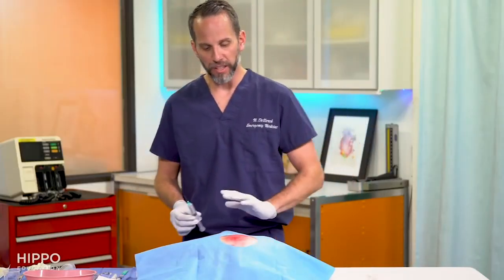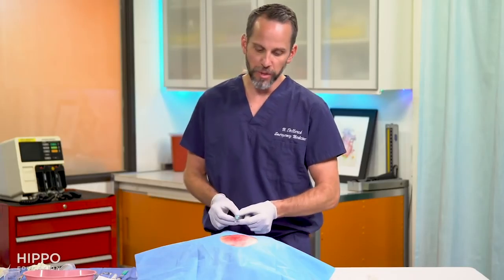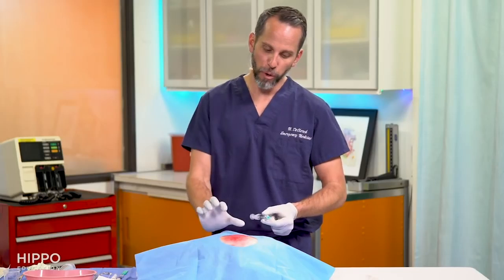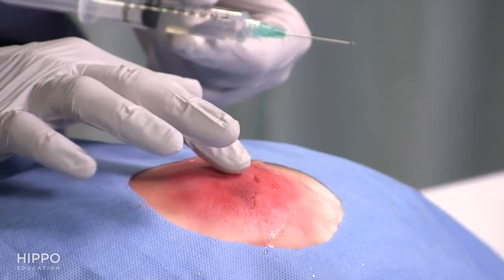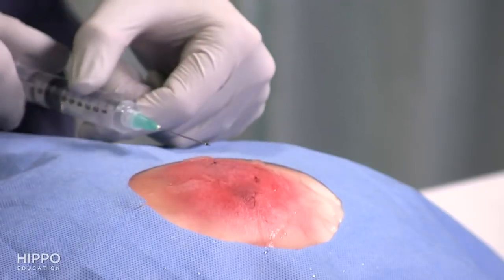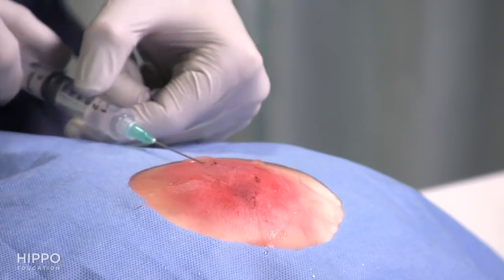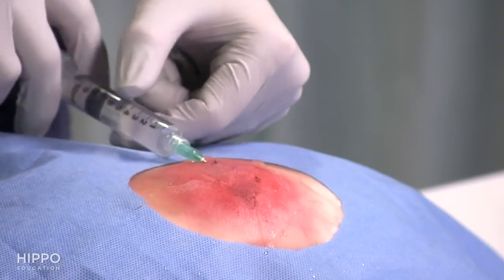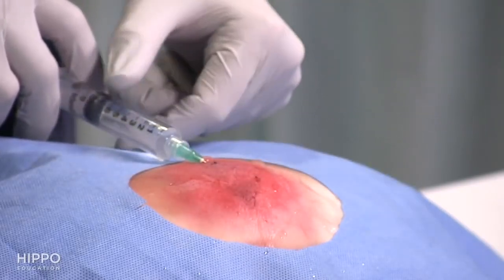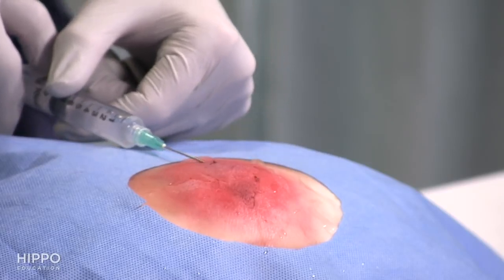After going completely around back to the starting point, the last part is infiltrating the dome of the abscess — you'll be making your incision at the point of most fluctuance. I like to start from an already-anesthetized spot and basically put lidocaine into the skin along where you plan to make your incision. Be aware this may be painful because you're infiltrating an area that's already tender and swollen.